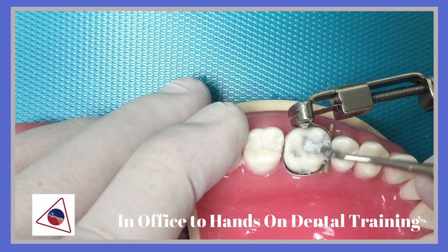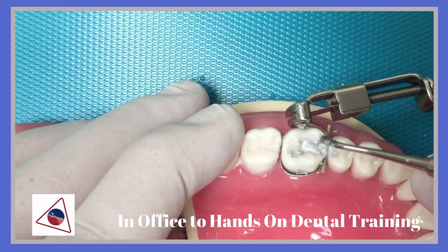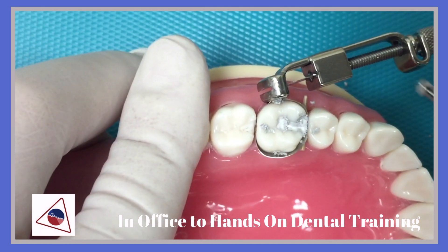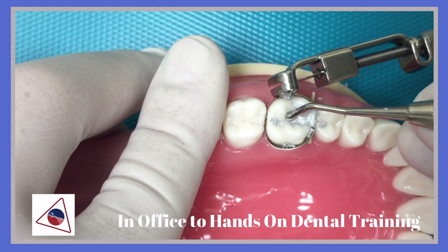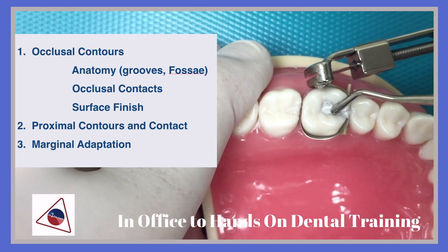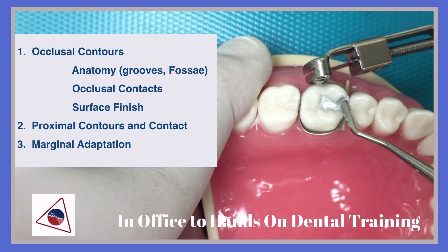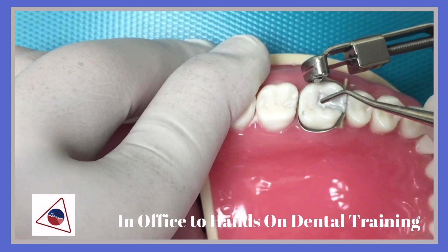At this point, you are on your way to condensing the amalgam without voids. You are pushing the amalgam towards the margins, smoothing out the amalgam preparation in order to restore the tooth anatomy. Being able to put in the central grooves and primary grooves as you are condensing and burnishing, you are able to do the occlusal contour at the same time, keeping in mind the proximal contour and the contacts, and making sure the marginal adaptation on the occlusion is without void and smooth.